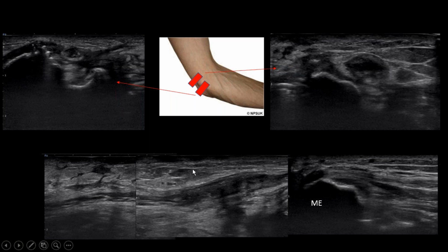There's a lot of edema that you can see in the subcutaneous tissue. That's the medial epicondyle, and you can see the nerve distally looks more or less uniform, but at this area there is complete transection. There are no nerve fibers intact in this area. This is the inflamed mesoneurium and outer fibrous bands that hold the nerve in place, but there are no nerve fibers in this area. So this is complete transection.